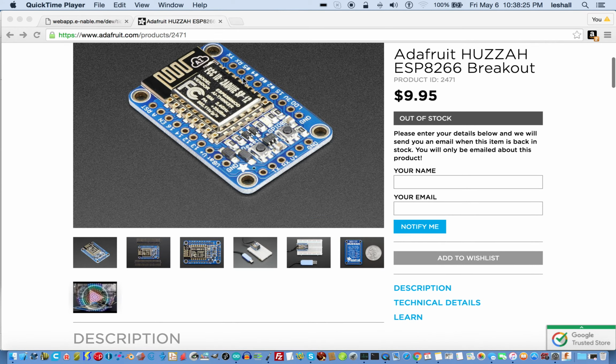Here is the board. This little thing is a single pole, single throw switch. GPIO0 it's connected to. And this is another identical little switch. It says reset. What we're going to do is press and hold the GPIO0 button and squeeze another finger on this teeny little board and push the reset, release the reset, and then finally release the GPIO0 pin. When we do that, the LED, which is in here somewhere, I haven't identified, there it is, that's got to be the LED right there. It will change from bright red to dim red. And the dim brightness indicates that it's ready for programming.